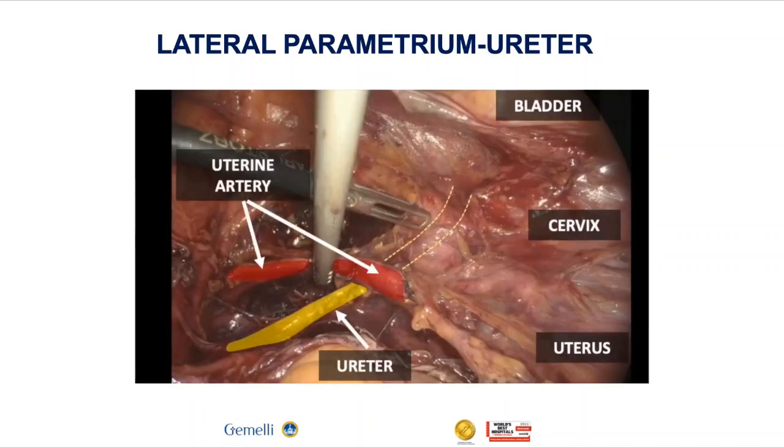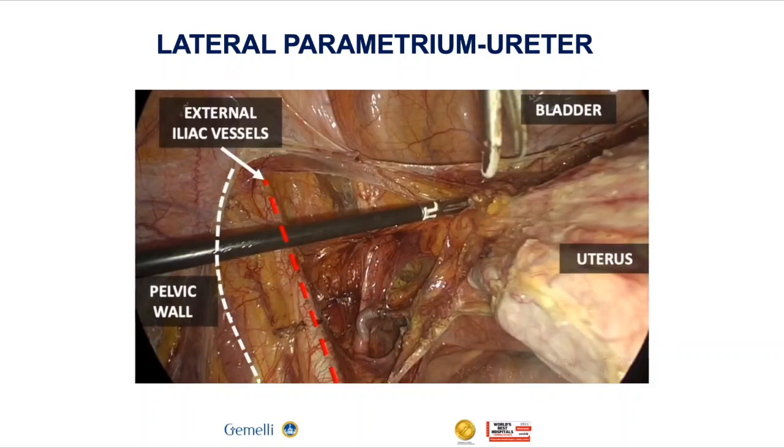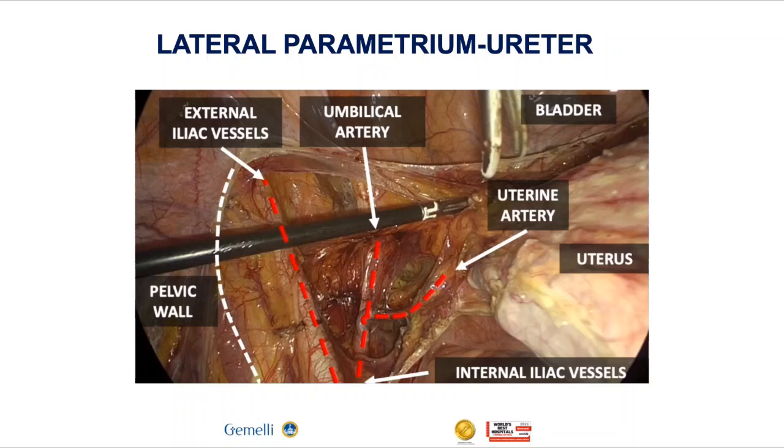This is the corresponding parametrium at laparoscopy. We can see the iliac vessel, uterine artery, and ureter. Then lateral parametrium, mid and lateral part.